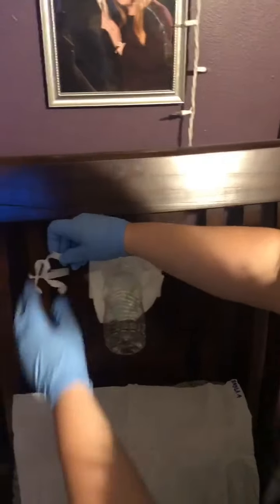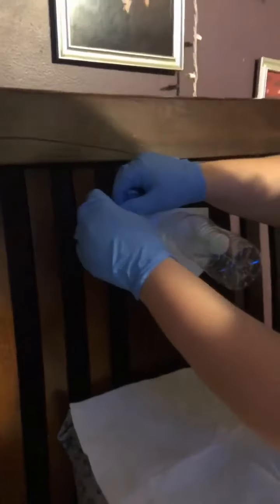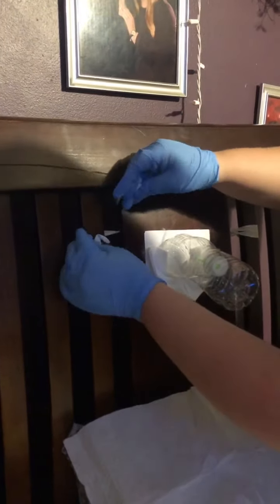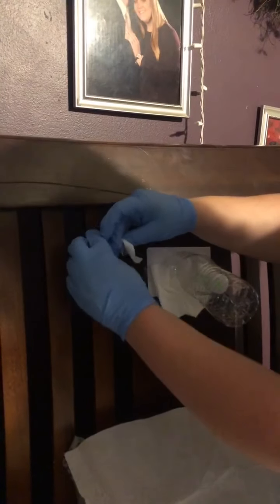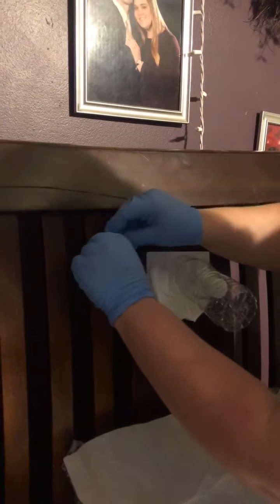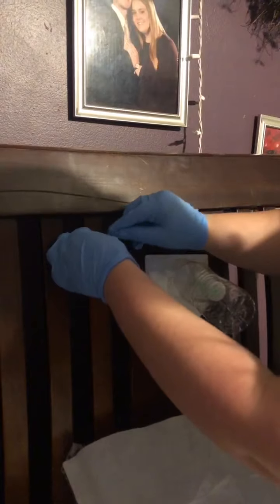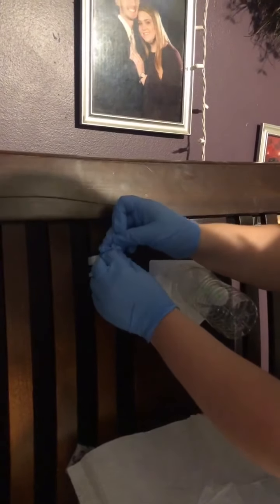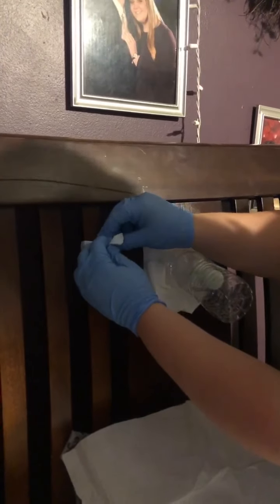And I'd come around to this side. When I'm tying this, I want to tie it around the patient's ear, double knotting, making sure that I'm not near the carotid artery.